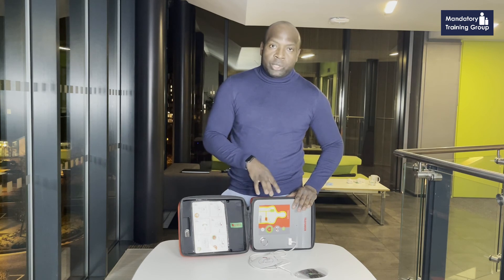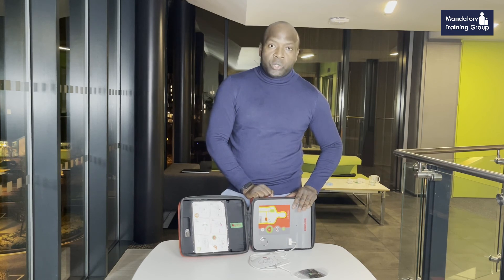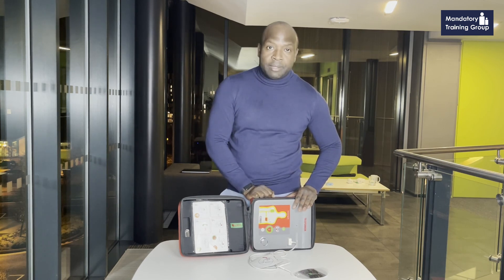If the person is not in a shockable rhythm — so they are not in VF or pulseless VT — it will tell you that there's no shock advised. You need to carry on with chest compressions: 30 compressions to two rescue breaths, following the algorithm you've been taught. So that's how the AED works — a very simple machine, but it can save a life if used together with CPR.